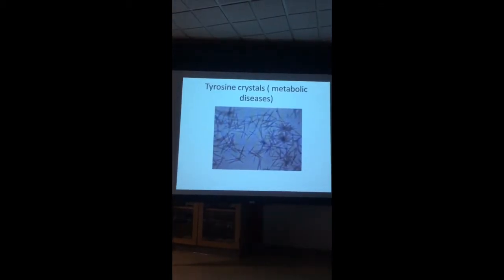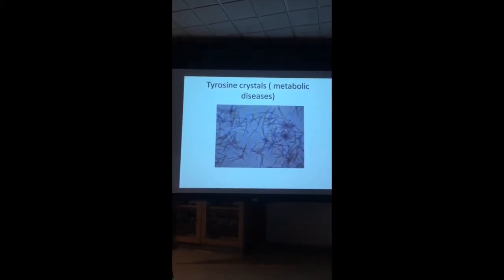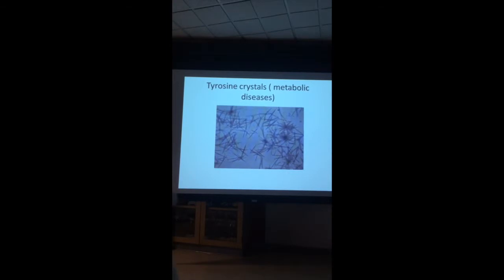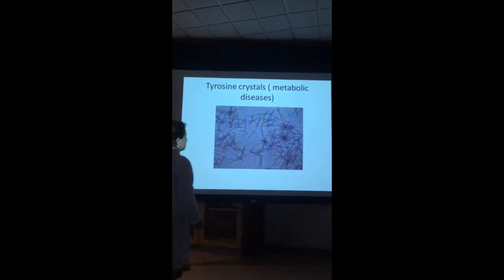Tyrosine crystals. They look like needles. A lot of things look like needles, but these are tyrosine. Maybe you can look right here. Look, there's a T. Maybe you can remember that.